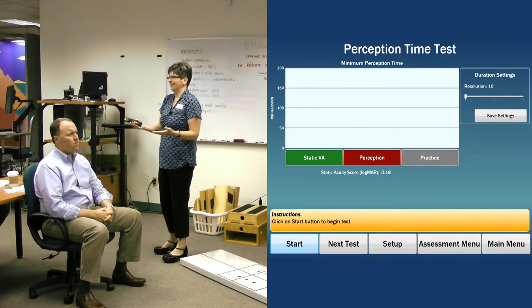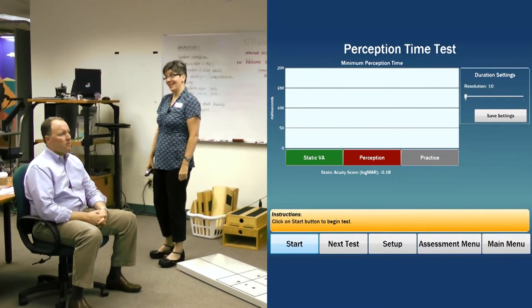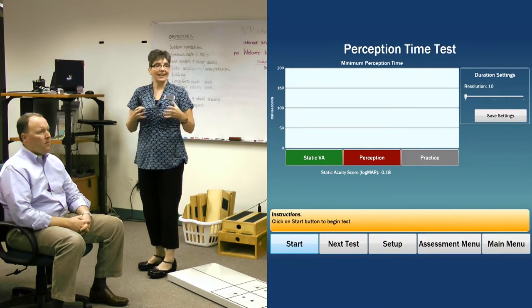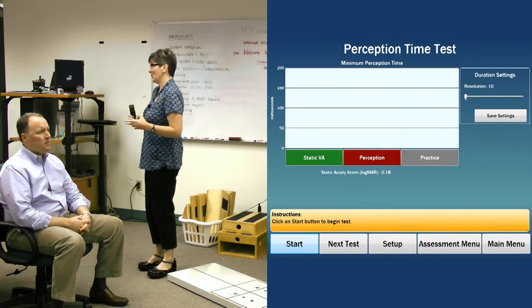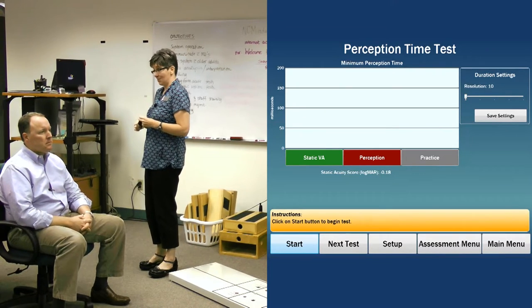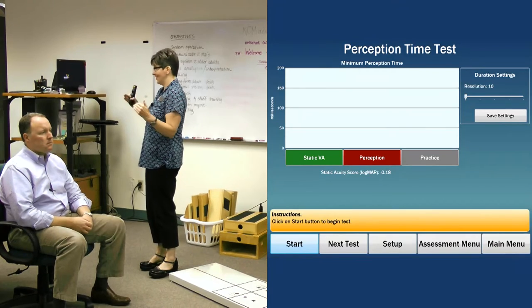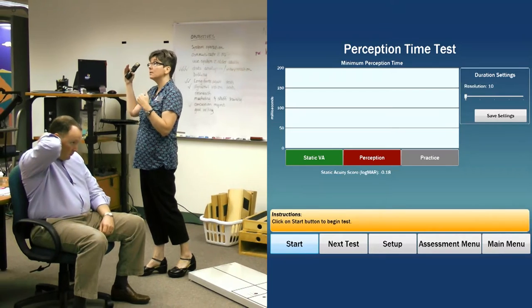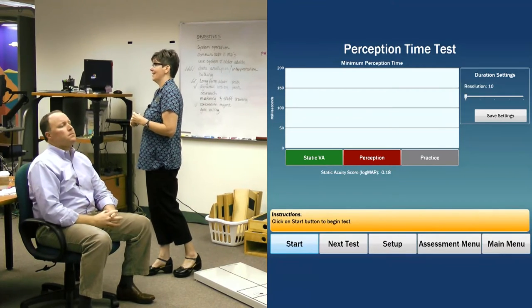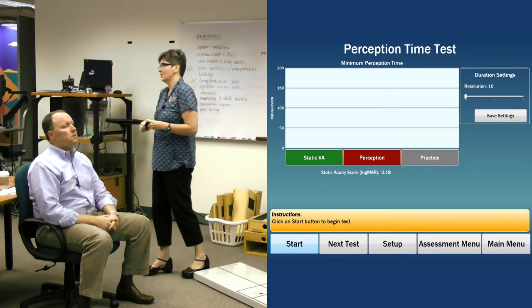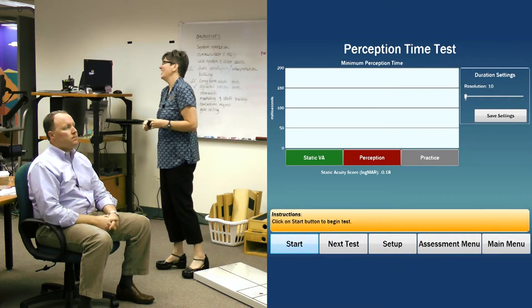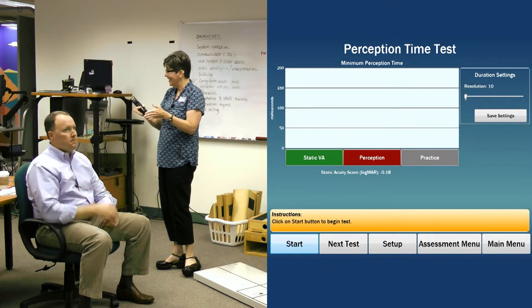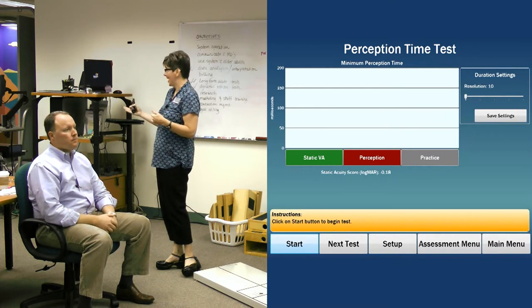Jason might say his optometrist told him his vision was a certain value. This is not a calibrated visual acuity assessment like you would get at the optometrist's office. This is a baseline I'm going to use to compare to his vision when I start moving his head. I just need a baseline because I want to see how it changes when I add head movement.